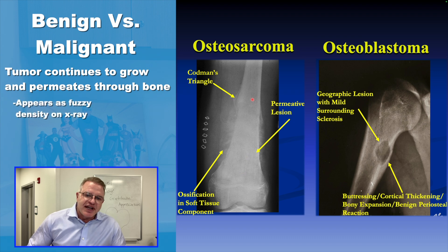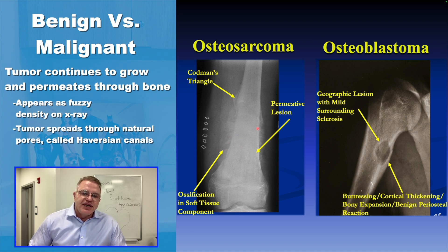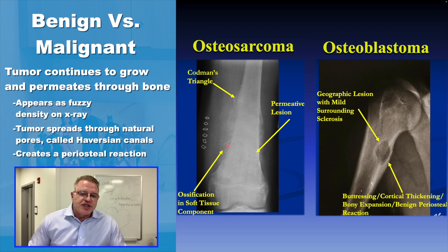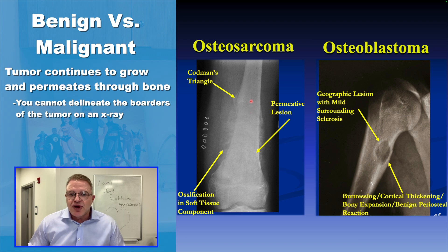We can see fuzziness within the center of the bone in the medullary canal where the normal soft bone exists. The tumor has grown so rapidly it spreads out through the natural pores, also called Haversian systems, into the soft tissues. It creates fluffy white cloud-like densities from producing bone — if that bone mineralizes or calcifies, you can see that fluffy white density. But you cannot make out where this tumor begins and where it ends; you can't see the perimeter or judge the difference between tumor and normal bone.